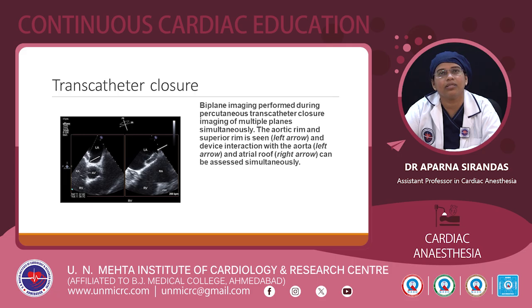And this is the transcatheter closure. Biplane imaging performed during the percutaneous transcatheter closure, imaging of multiple planes simultaneously. In this you can see aortic rim and superior rim is seen in the left arrow, and device interaction with the aorta and the atrial roof can be assessed simultaneously.